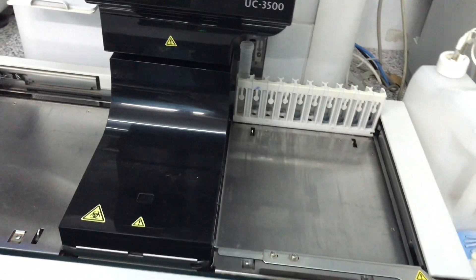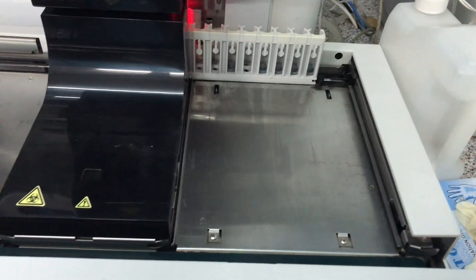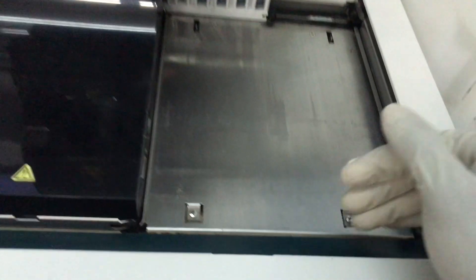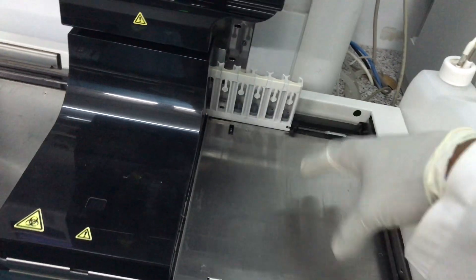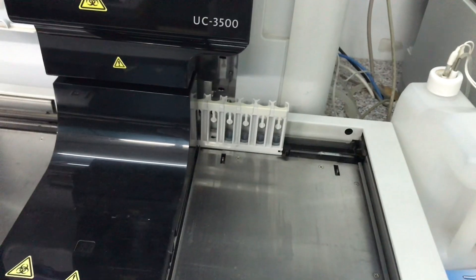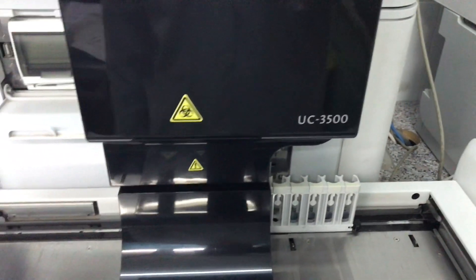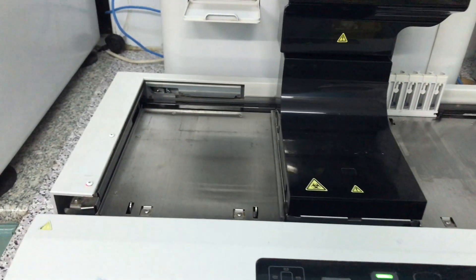You'll notice that the machine will begin to work. What we have here is a lever — we call it the rack feed-in lever. It feeds the machine from the conveyor point. This is the conveyor point; it has a conveyor belt that moves samples to the analysis point. It feeds into the machine and then begins to scan each of the tube contents and analyze them. Currently the machine is working and analyzing the sample.